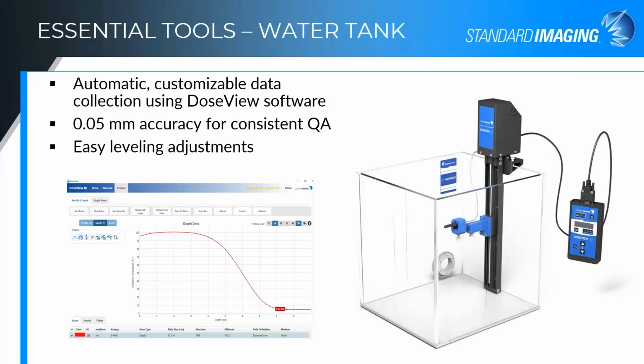However, if you want to scan a % depth ionization curve and you want to convert that to dose, and then figure out where your, say for electron beams, find your DREF, then put your chamber at the reference depth, and then make your measurements for TG51 or TRS 398, you can do all that through the software interface.